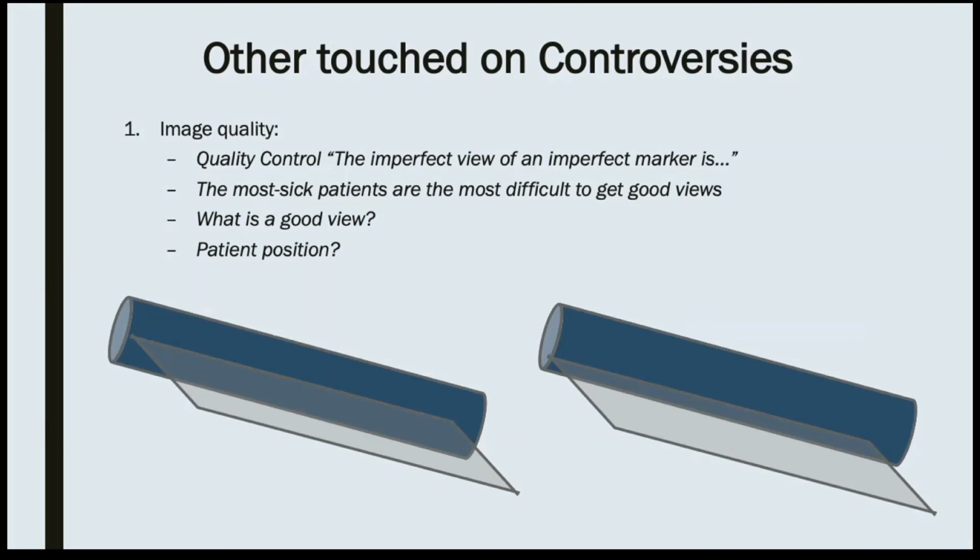And when do you know you're in the middle? Is there a defined middle? Are you looking at the walls? And what about the patient position? All the studies that we have, are the patients lying flat? Are they at 45 degrees? That is not mentioned in the data.